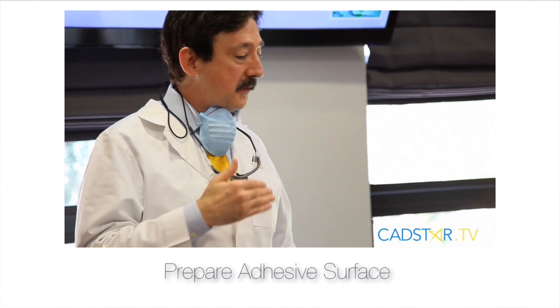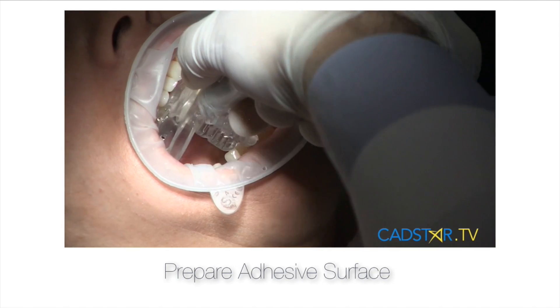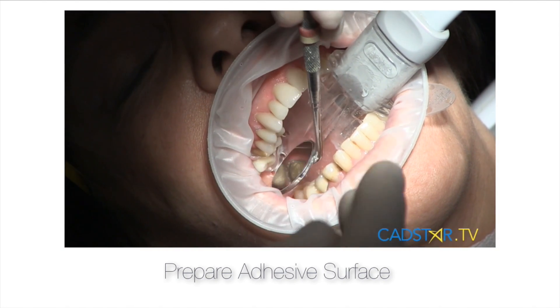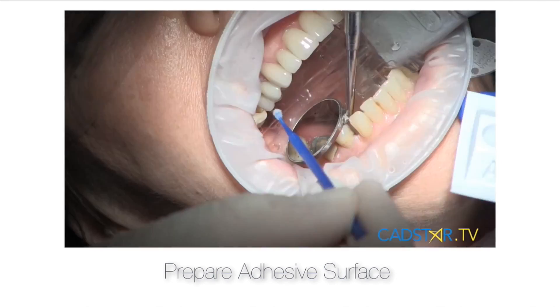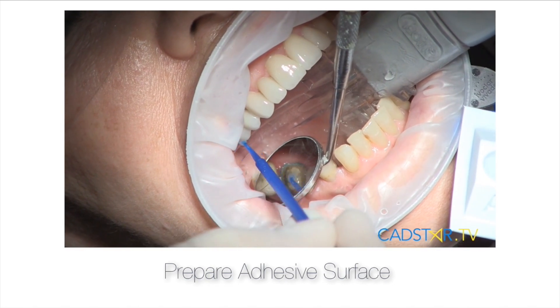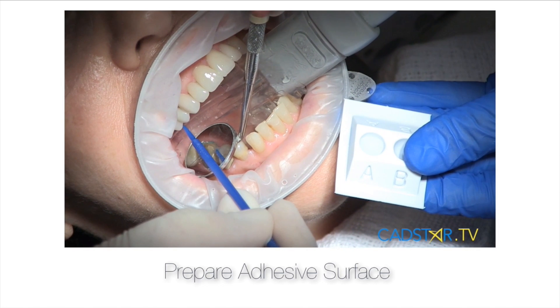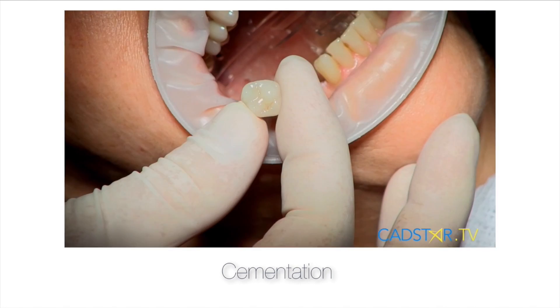I will then be called for the bonding process if this has been delegated to one of my great team members. I'll use the Isolite plus the OptraGate — this provides excellent isolation — and I'll process my tooth accordingly. I want to make sure there's no fluid flow from the sulcus, and then I'll use a primer or some type of conditioner like Telio Bond or Gluma. In this case, I'm using a very thin primer. I'll then cure that, and I want to make sure it's no thicker than 10 microns.